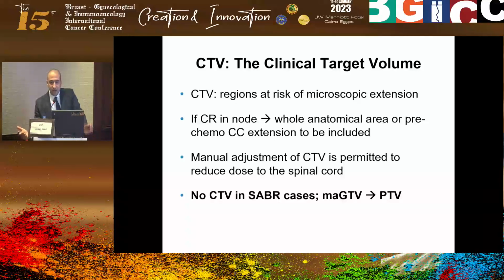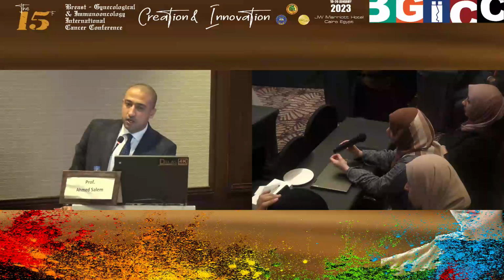But I would say in the mediastinum, you're always sure because you have nodal anatomical boundaries of the stations. So you know the station 4R's cranial extent is this much and its caudal extent is this much. So you're always sure where you are. But in the lung tissue, you're never 100% sure because sometimes the lung tissue changes a little bit with treatment. So this is the complexity that you have. Fusion with initial PET can sometimes help.